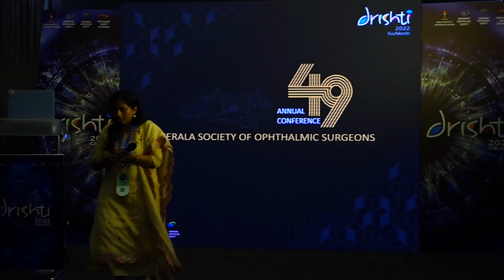Thank you very much, Dr. Deepa. It was an excellent presentation. In spite of not having a video, we could get a clear idea about the YAG capsulotomy. But sometimes we get into a dilemma when the foveal reflex is dull and then there is a small PCO as well.